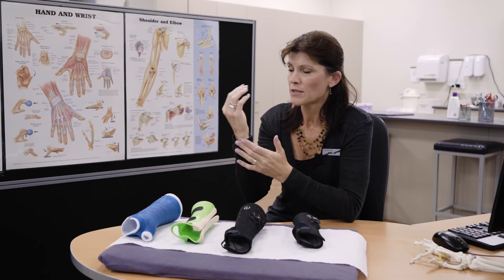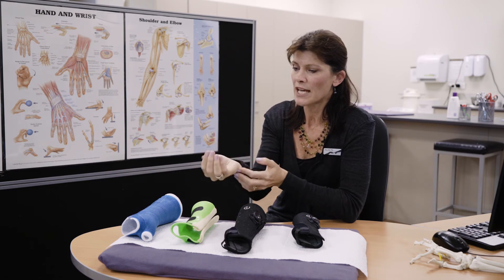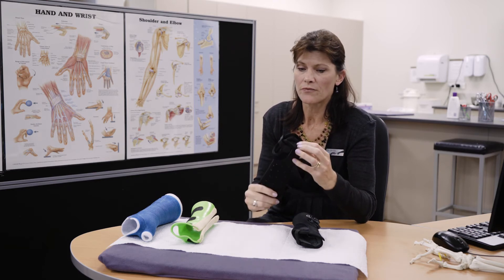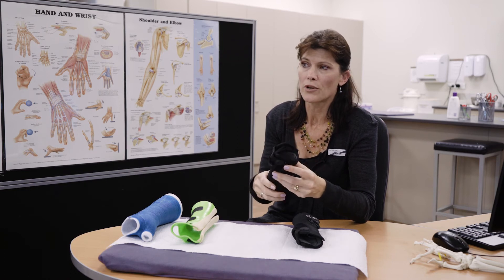If your pain is more on the ulnar side — the little finger side of your wrist — it's actually the rotation of your forearm that is contributing to or maintaining that pain. So we go for a longer option that's very good at not only immobilizing your wrist but also reducing your forearm rotation.